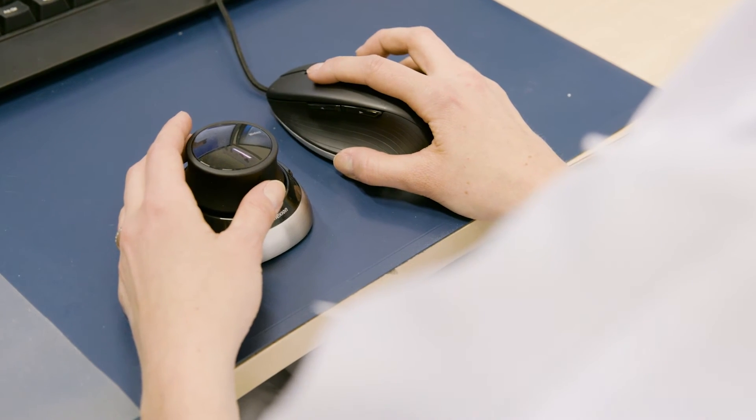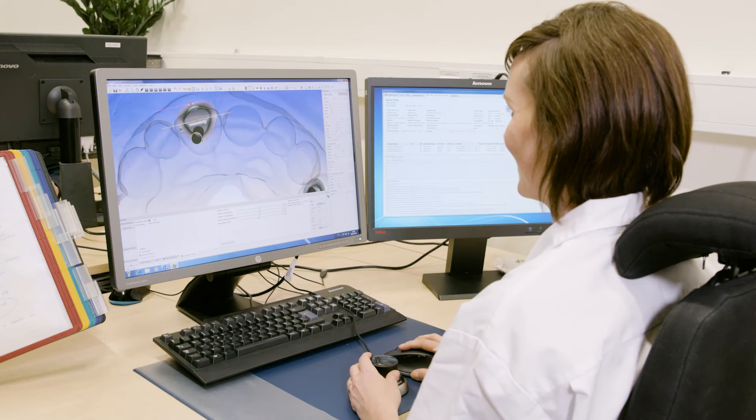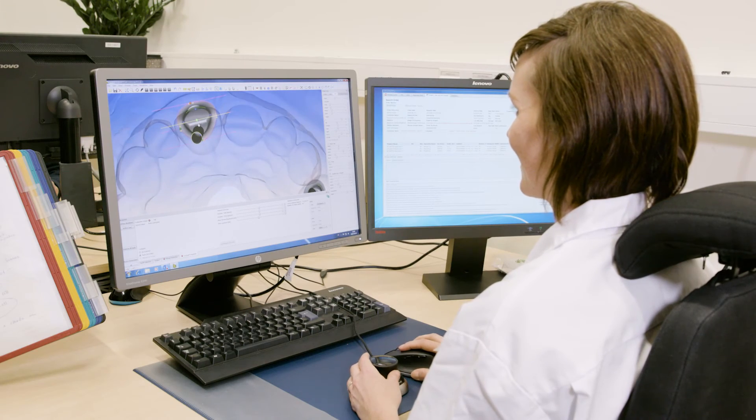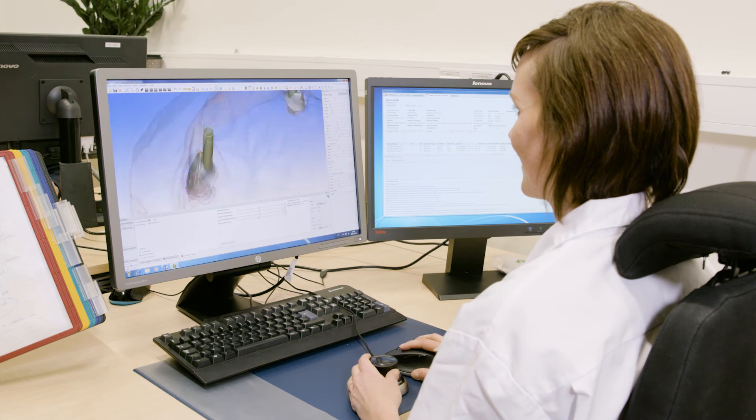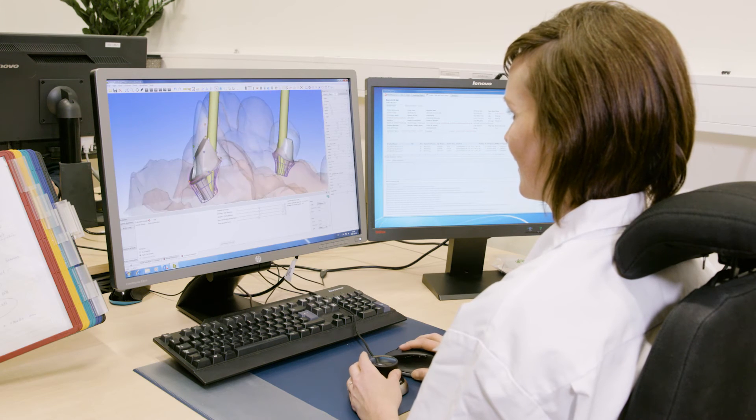We are very happy that we have software which is facilitating this approach by designing on the computer. In the final result, we have a good nature-like restoration starting from the transition zone and then ending in the crown.